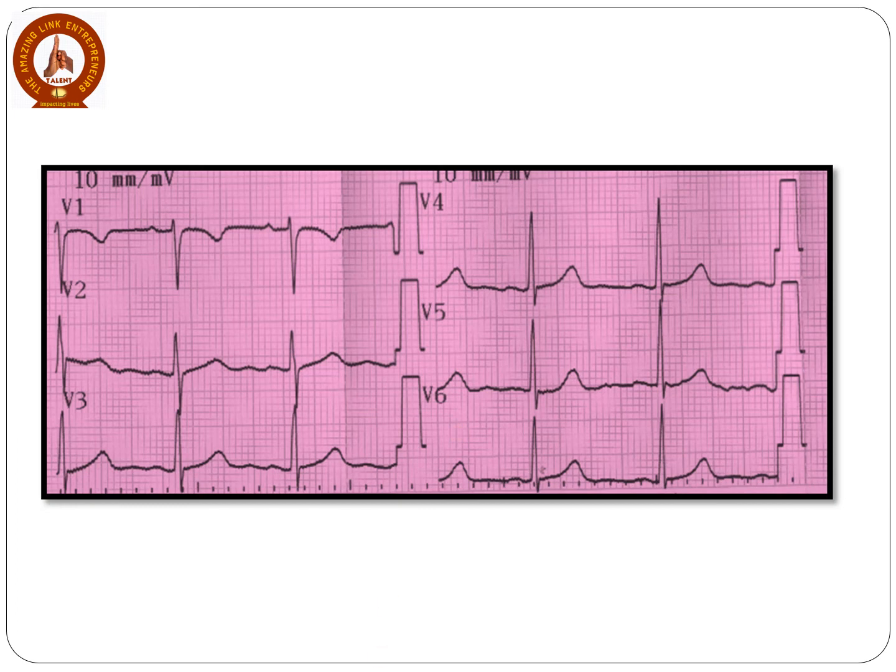Next example, we look at this ECG. V1 contains dominantly negative QRS complexes. But in V2, there is a transformation. V2 contains equiphasic QRS complexes, up and down balance. So that means the transition zone has shifted to the right precordial lead, V2. So this is early transition or anticlockwise rotation or counterclockwise rotation. If you look at the other leads, they are dominantly positive.